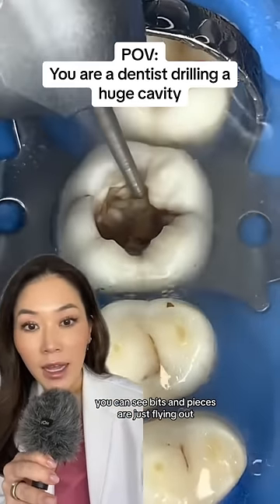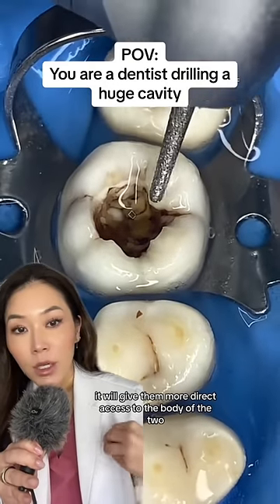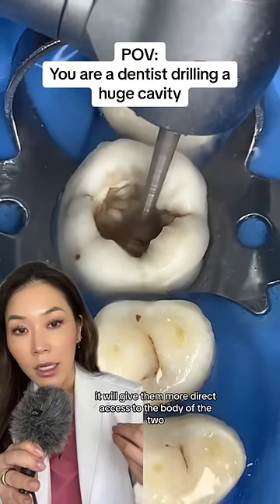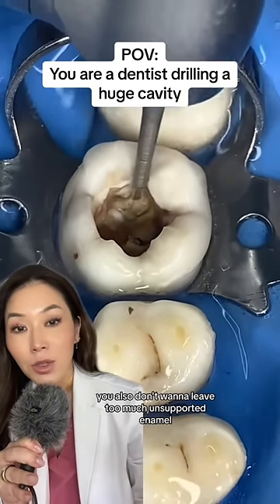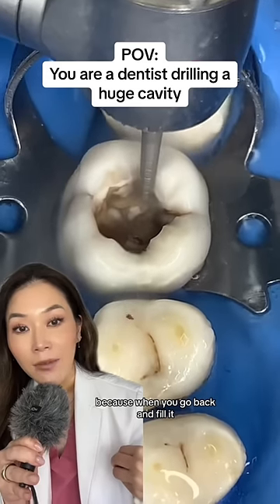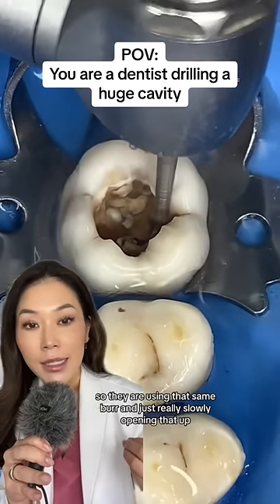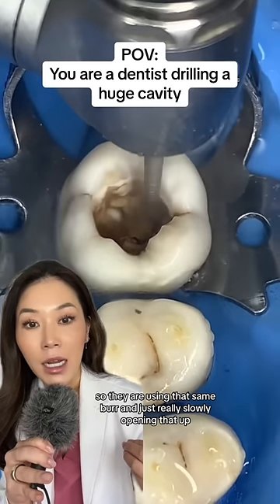You can see bits and pieces just flying out, and as they open this up it will give them more direct access to the body of the tooth. You also don't want to leave too much unsupported enamel, because when you go back and fill it, it's not going to be supported in the same way. So they are using that same burr and just really slowly opening that up.